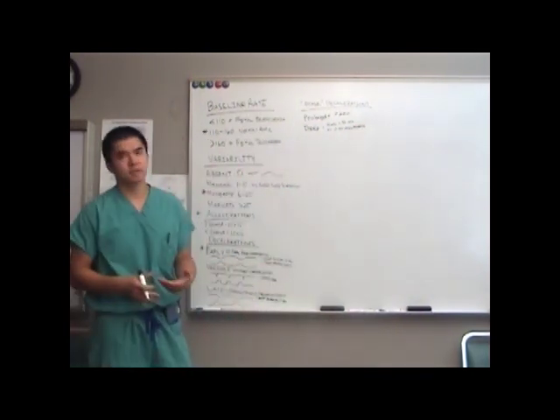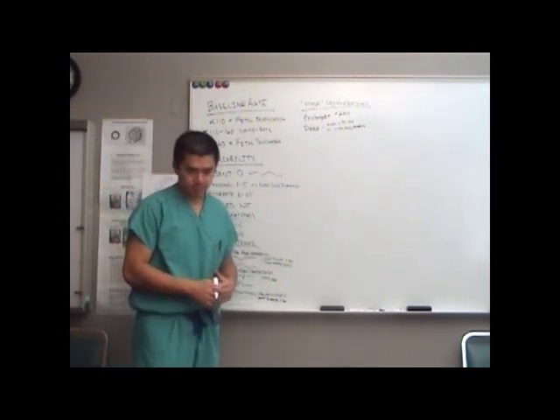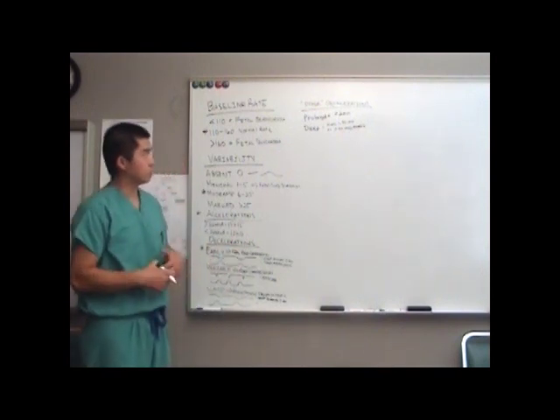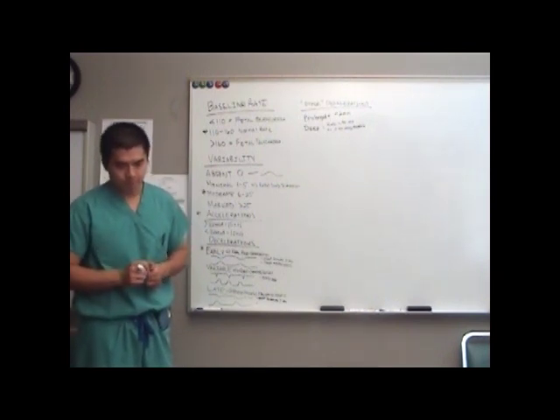So there's not an exact definition, but if it's below 90 or 80, it's definitely deep. And so sometimes you'll hear people say, oh, we had a deep decel, or you can even have a deep prolonged decel. So you may hear those terms from time to time.